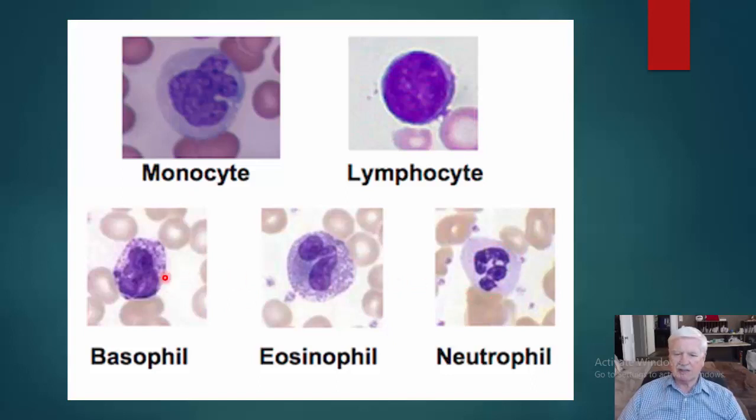These are granulocytes across the bottom. That's a neutrophil. Then this is an eosinophil, so they say. I couldn't prove it by me because usually on a slide, the cytoplasm looks redder than that. And this definitely is a basophil.